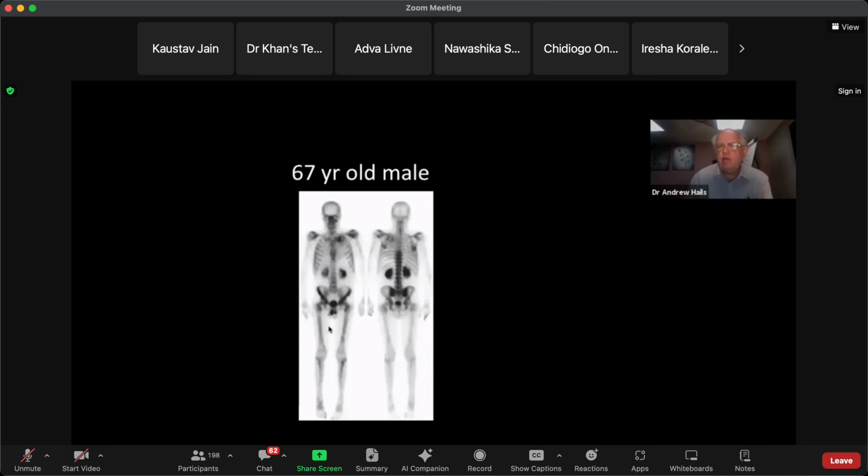Okay, I'll point out that what we're really looking at in this case is decreased uptake. This patient's had radiotherapy, so you go up their spine and then there's an abrupt, non-anatomical cut-off there with very little uptake here. Obviously, you want to look at plain films and know more about the patient, but this was really just to demonstrate that this abrupt end of uptake is what you would see with radiotherapy.